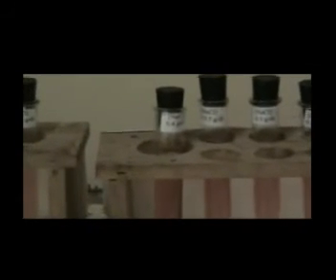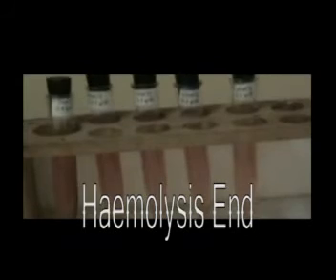And here, the 0.4 tube, and still there are some deposited cells at the bottom. And the next tube, 0.35. This is the tube with 0.35. You can see no difference in color intensity and no deposited red cells at the bottom in the tube with the 0.35 concentration.